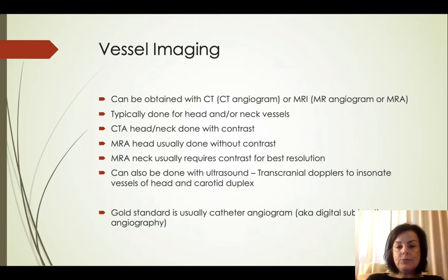CTA, that's probably the study we get the most, especially in a stroke setting, because we've already got the patient in the CT scanner, and it's very quick and you can get very good images. You use the iodinated contrast, as we discussed before.